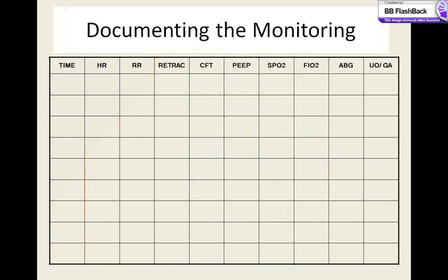Documenting each observation will help in ongoing assessment of the patient as a whole. Such charts are required to ensure smooth progress of a baby while on CPAP.